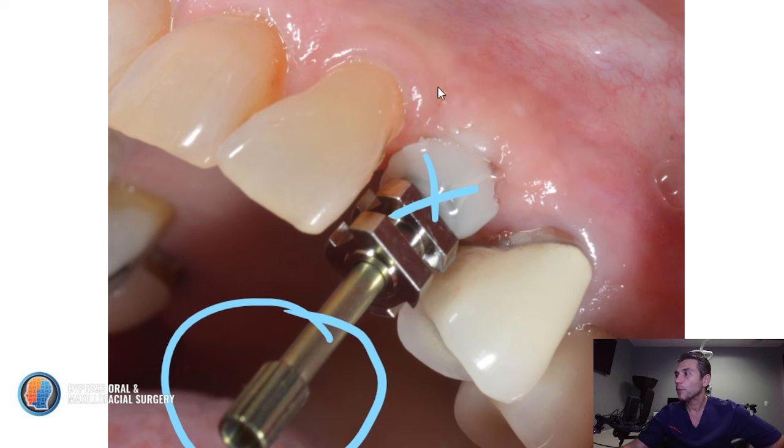And so when the laboratory pours this, now they have an idea of what you want the soft tissue profile to look like, and in this case it should look something like this. And so when they make a screw retained crown or even a custom abutment, they know exactly how you like it.